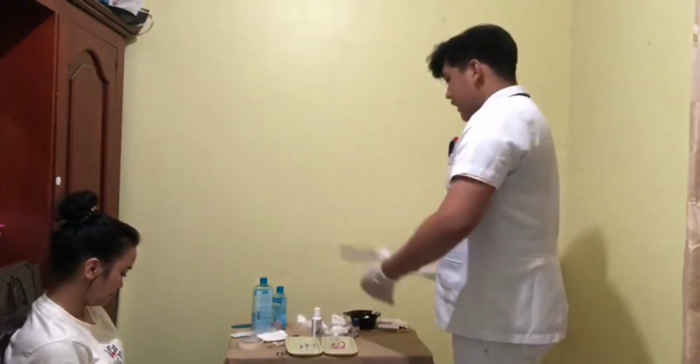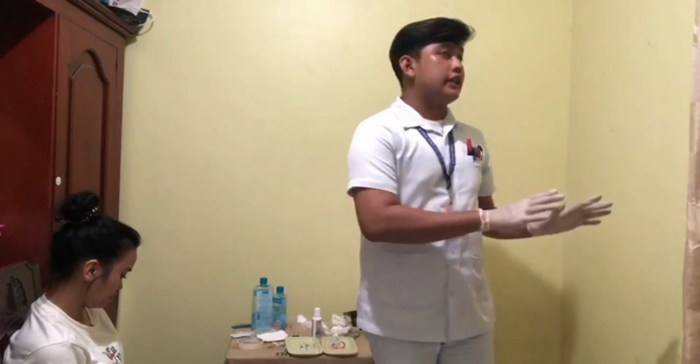Okay. So after explaining, we'll provide the client her privacy so that she can be at ease. I already locked the doors and closed the curtains beside me. Then we'll select the site to be administered, and it is 3 to 4 finger widths below the antecubital space and 1 hand above the wrist. The forearm is convenient and easy to locate for introducing an agent intradermally.